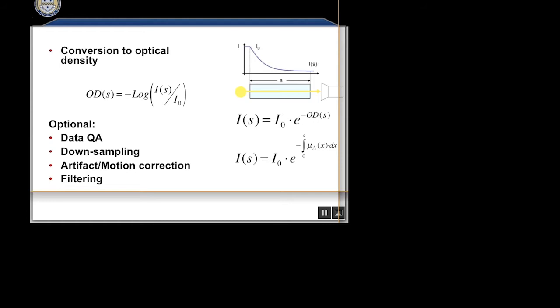It's a concept introduced in maybe freshman chemistry class in college, in analytical chemistry. The idea is, if I have a test tube and I shine light through it, I can figure out what the concentration is, as long as I know some of the physical properties, that is the extinction coefficient of whatever the compound is, and the distance, the path length that the light traveled through the sample.